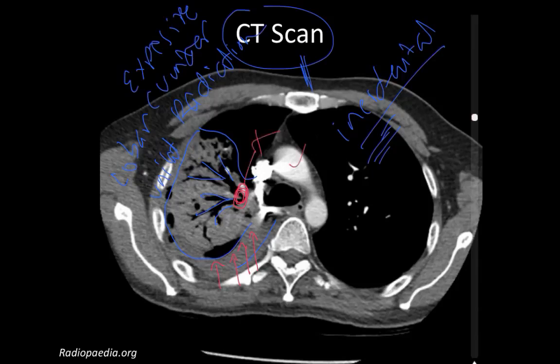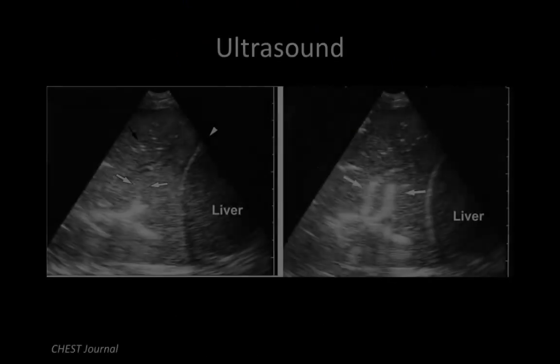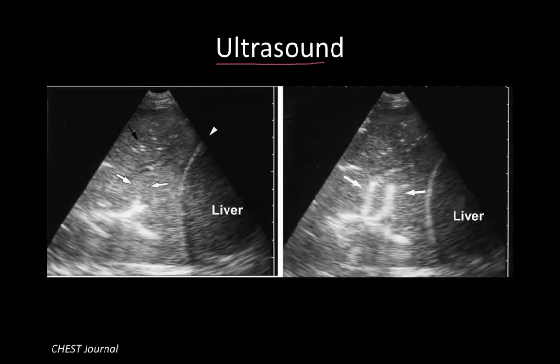And sometimes, if you've done a contrasted CT, it'll show you if there is a PE, and if this infiltrate is more consistent with pulmonary infarction rather than a pneumonia. You would spare your patient unnecessary and inappropriate treatments that way. Although people associate the use of ultrasonography with looking at pleural effusions, an ultrasound can actually show you a pneumonia very, very well, and sometimes earlier than a chest X-ray can show it.